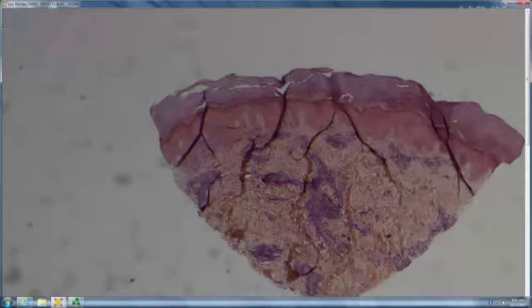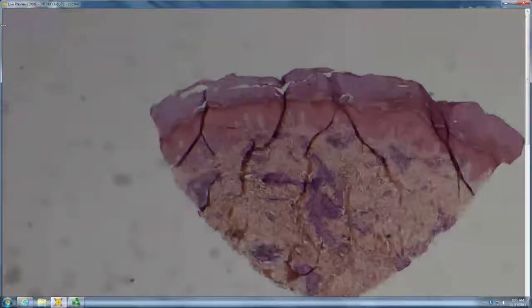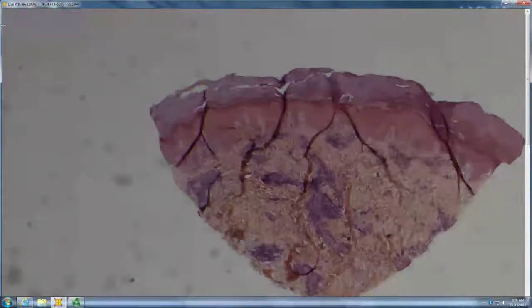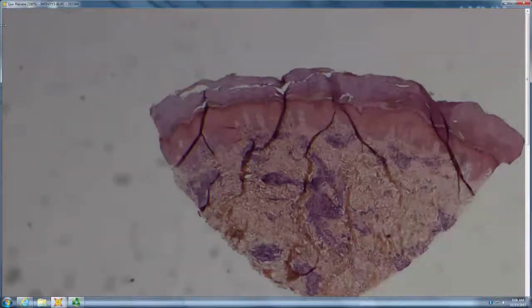So composers, yes, exactly. All right, so this looks pretty much like a deep vessel vasculitis, with some keratosis. There is a little karyorrhexis. It's not real advanced, but there are definitely some eos, some karyorrhexis. So you sort of wonder what's going on here. There's a lot of dense collagen there, and a lot of new vessel formation. So this is probably the late healing stage of a deeper vasculitis.